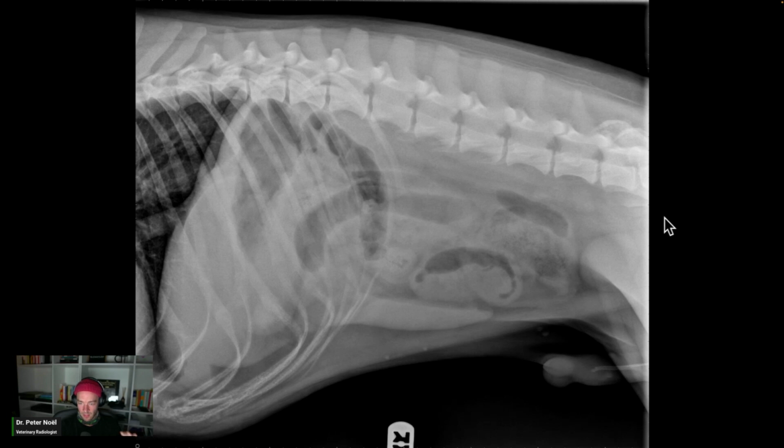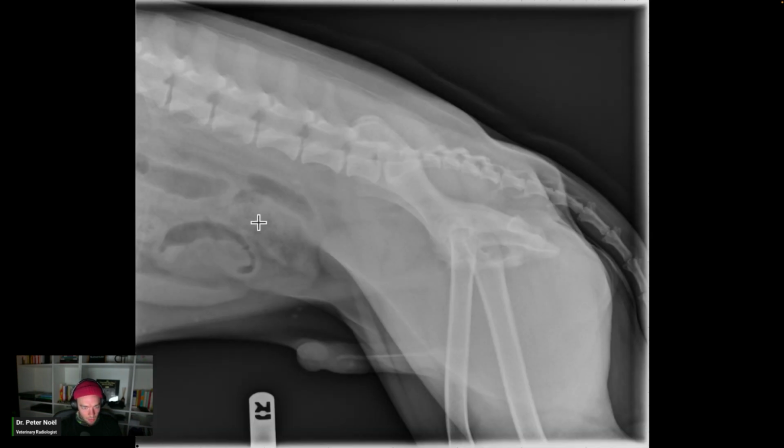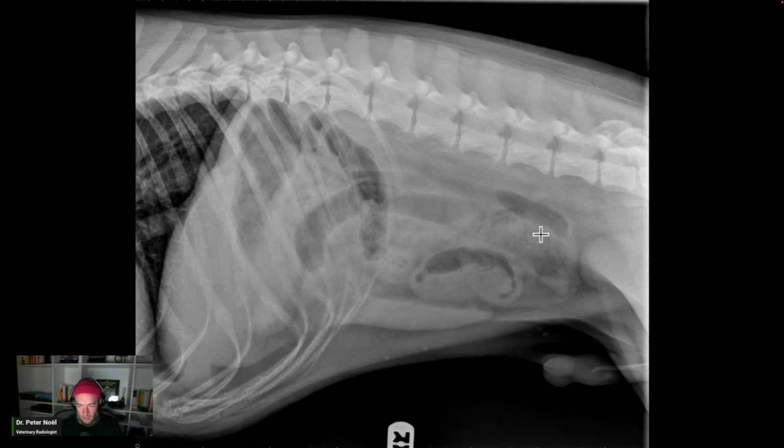So if you panicked, you could do a pneumocolonogram. For those you don't want to get a nurse, you want to get an intern. So you do the pneumocolonogram, and then you look and it'll be much more obvious what's colon or not. But this particular loop right here looks too big, right? This is too big. This structure right here, that one's a little bit too big.